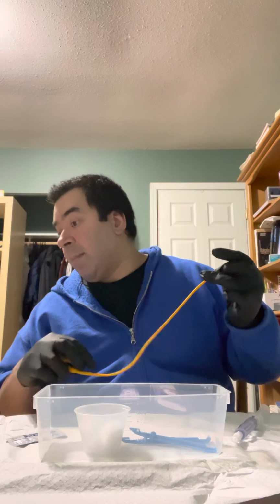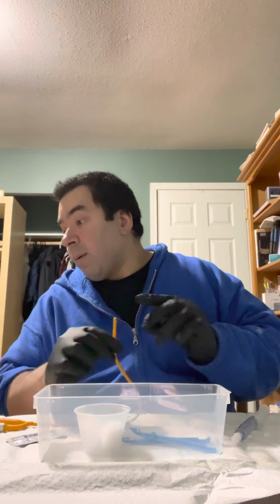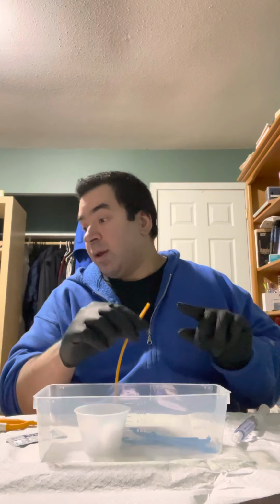I will pick up the catheter 3 to 4 inches from the tip. I will then gently apply upward traction to the penis to straighten the urethra with my non-dominant hand. I will then slowly insert the catheter through the urinary meatus.